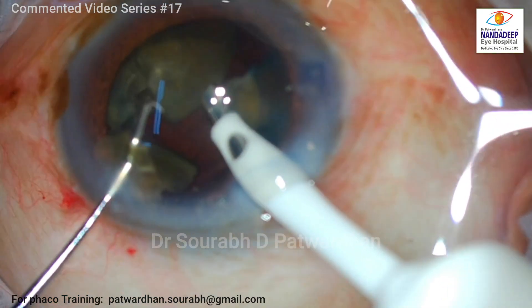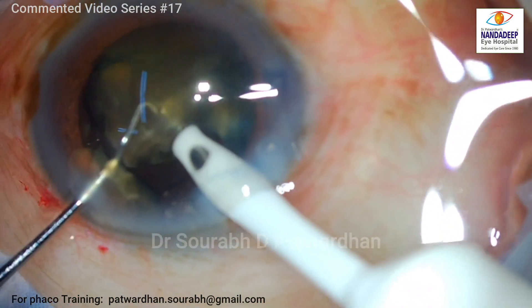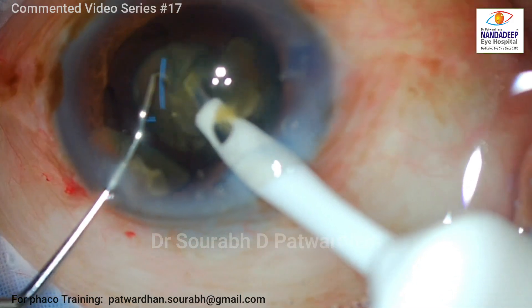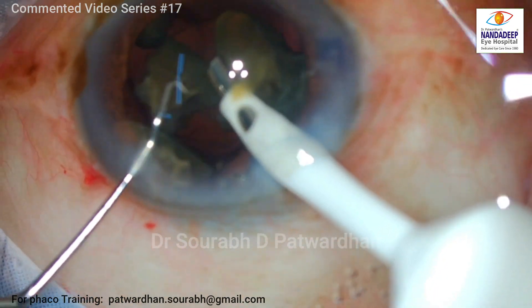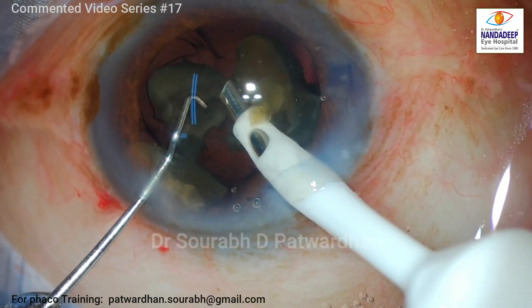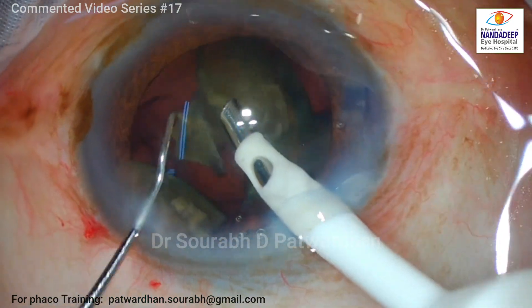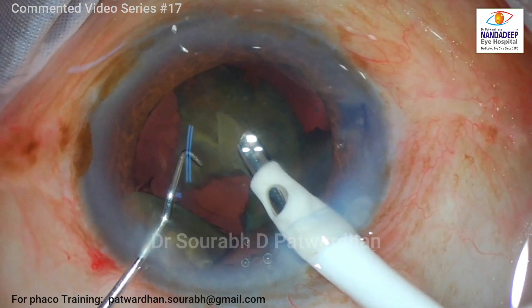Some surgeons advocate placing the IOL at the beginning to use it as a scaffold and then doing the emulsification — that is also a good approach, particularly for beginners. Now I am well set with these parameters and know how controlled the phaco energy is being delivered. The followability is quite good with these settings and there is no much chattering in Hyperburst mode with 11 millisecond burst width. The advantage of using burst mode is that very low energy is used, and there is no risk of corneal wound burn, which I am also closely monitoring because this machine uses longitudinal phaco power — it does not have torsional phaco. All the time we have to watch the posterior capsule and monitor for any fluctuations in the anterior chamber.